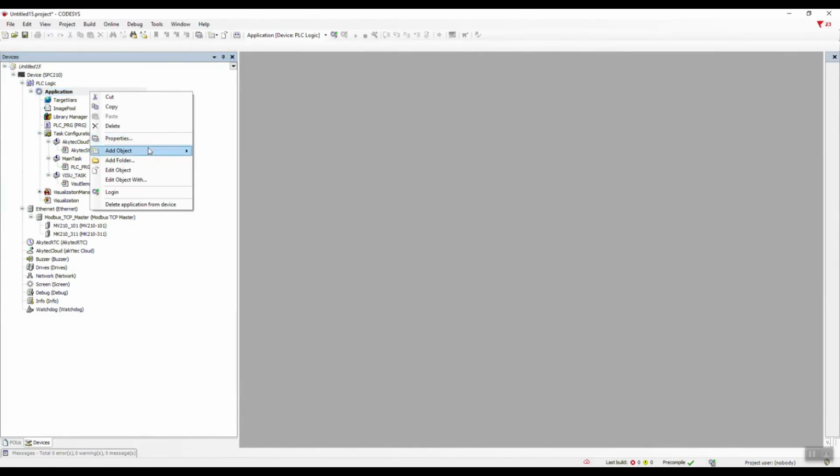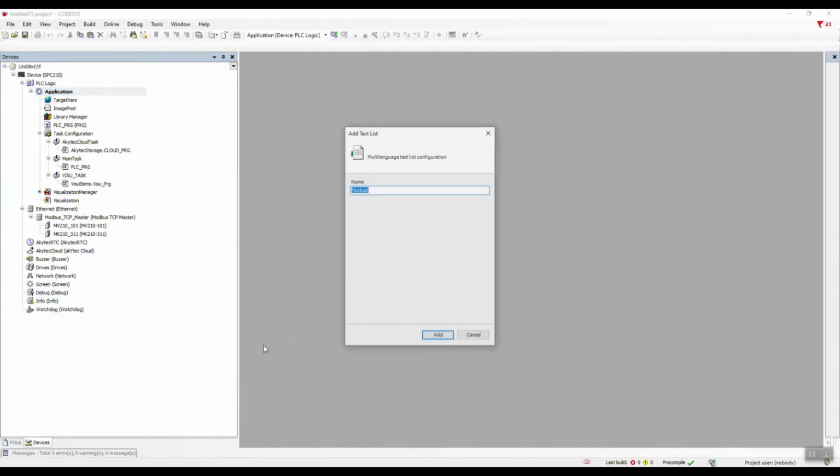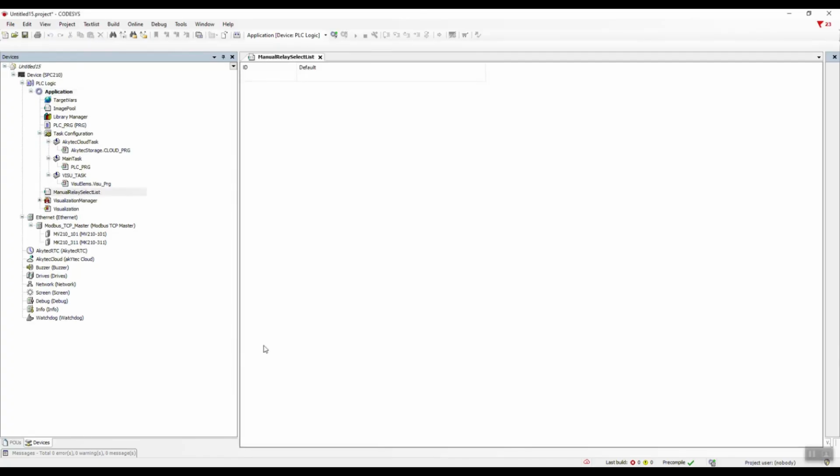Then proceed to add the specific text list, which is titled Manual Relay Select List. To configure the main relay selection mode, enter the corresponding values in the ID and default columns, as you saw in the second video.